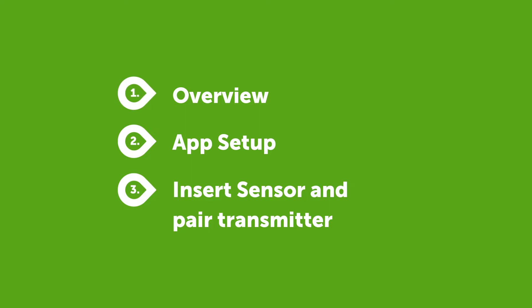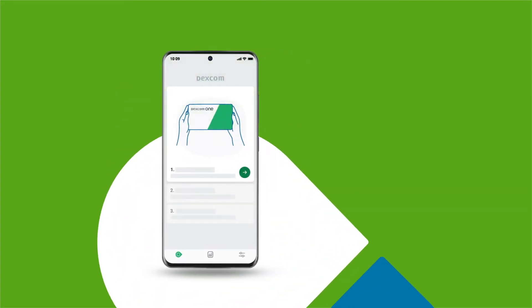You will see an overview to learn how Dexcom One works. You will set up connectivity in the app and you will insert your sensor and pair your transmitter. After login the app shows you an overview of how the Dexcom One works. Read these screens to learn everything you need to know about Dexcom One.